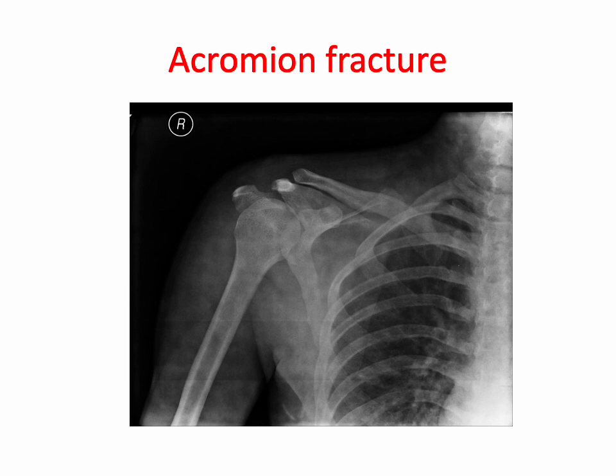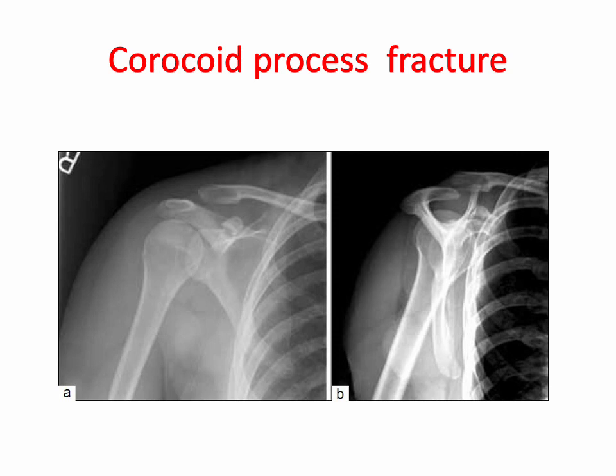Here we've got a fracture of the acromion, which is displaced. This is the medial portion of the acromion and the lateral portion, and this is the displaced part, so the degree of displacement. And a displaced and angulated fracture of the coracoid process.